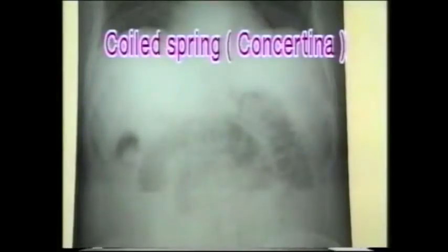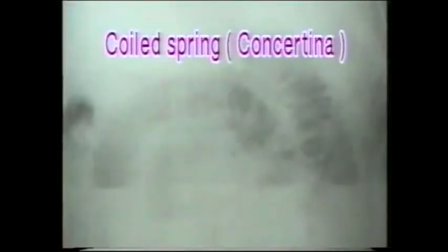This is another X-ray showing concertina appearance. So this is a distended jejunal coil. The valvae conniventes occur very close to each other and are seen across the full breadth of the intestine, hence the characteristic coiled spring appearance.